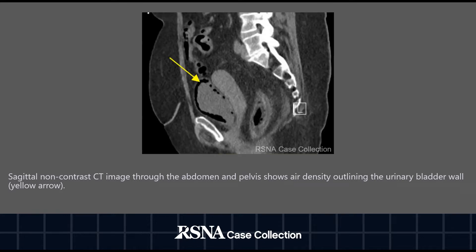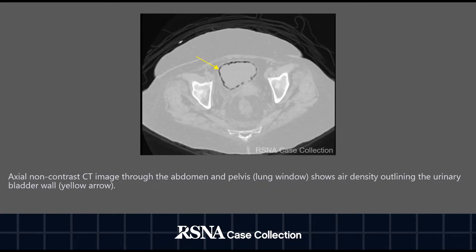This is an axial non-contrast CT image through the abdomen and pelvis in lung window showing air density outlining the urinary bladder wall (yellow arrow).